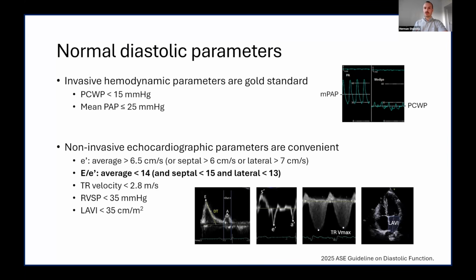So in summary, echo really does provide a better value proposition than invasive hemodynamic testing because it's much more accessible, and it can be done both in the outpatient setting and the inpatient setting, rather than a right heart cath that requires a cath lab. It's also safer for the patient, so there's no skin puncture, and there's also no radiation. It also ends up being cheaper per patient for the healthcare system. And so overall, echo has become a very useful tool to look at diastolic parameters.